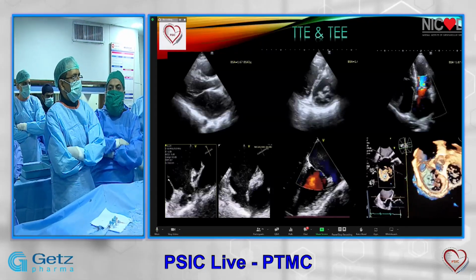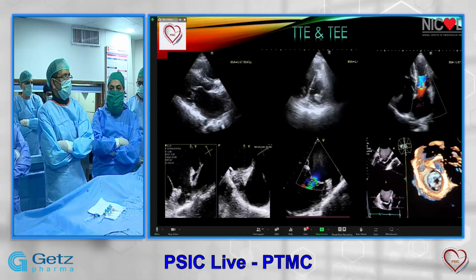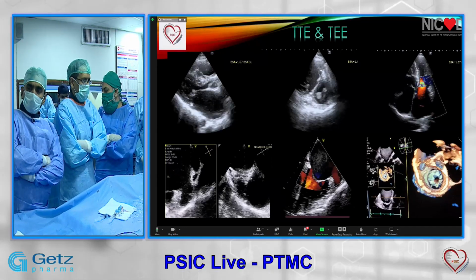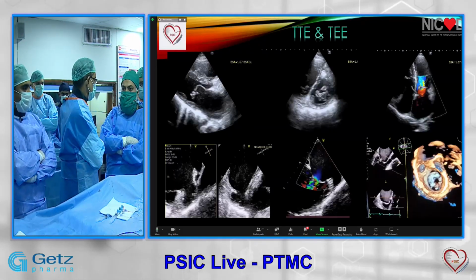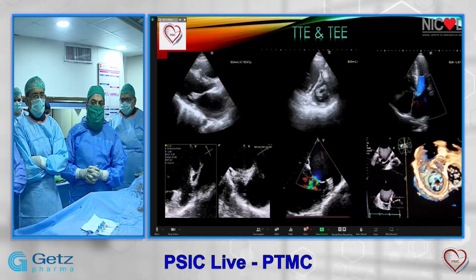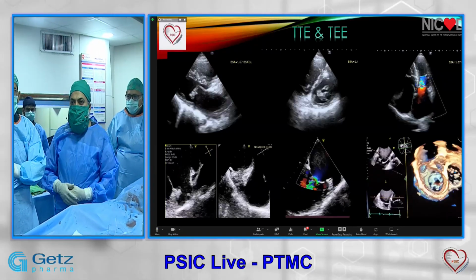Dr. Navidullah Khan will just introduce the inventory that is to be used in this case with the Inoue balloon technique. Okay, can you hear me? Yes.